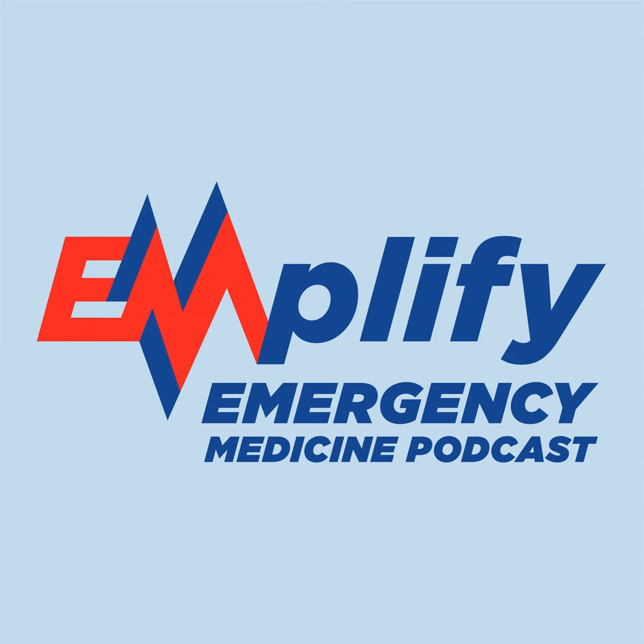The next one then is our fraction of inspired oxygen, or FiO2, which is really just the percent of oxygen that's being delivered to a patient. Most of us, I think, are usually accustomed to just starting them at 100%, but there is evidence that that's not necessarily the best for the patient, especially if you're going to maintain that for a while. And our goal is then to decrease as fast as possible.